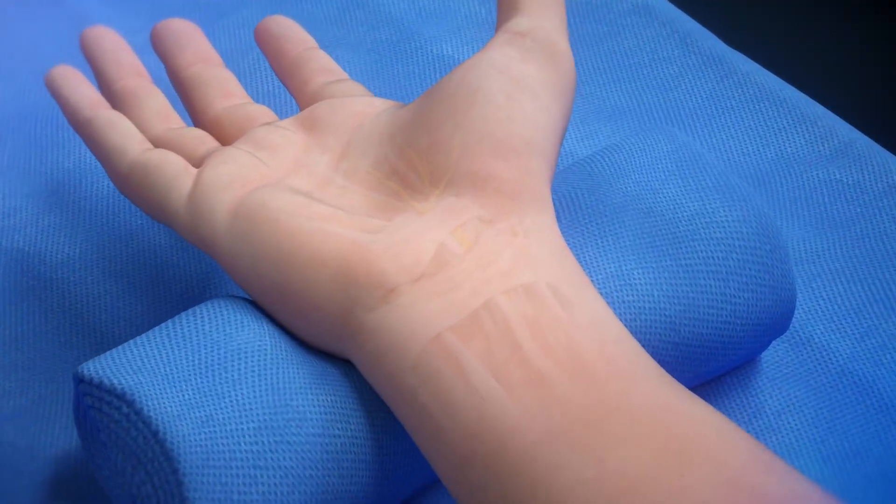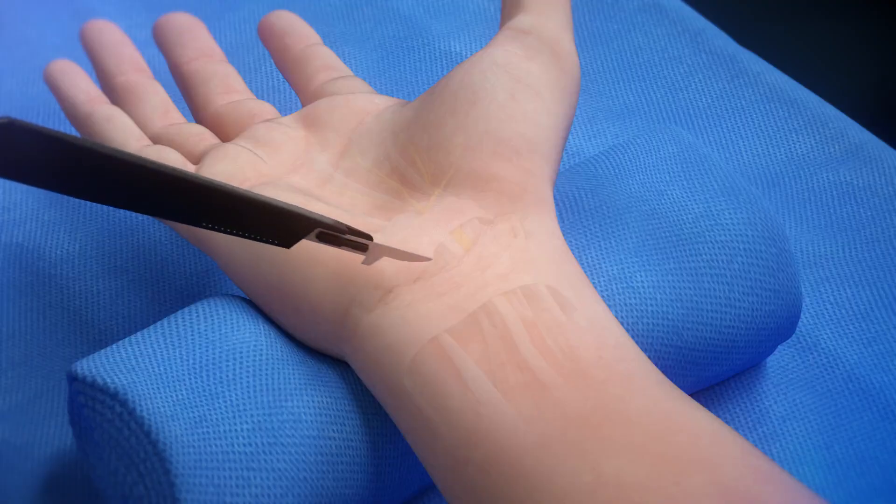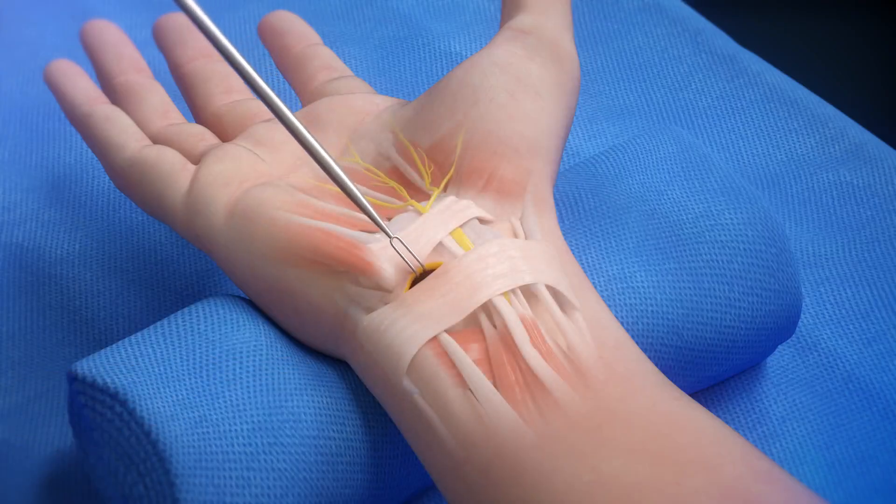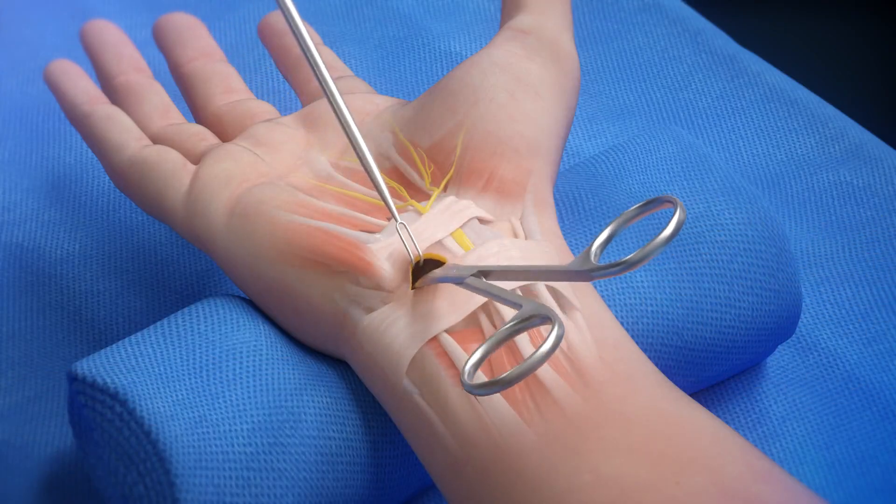Make a transverse incision in the proximal wrist crease between the FCU and the palmaris longus tendons. Dissect down through the antebrachial fascia to gain access to the carpal tunnel space.